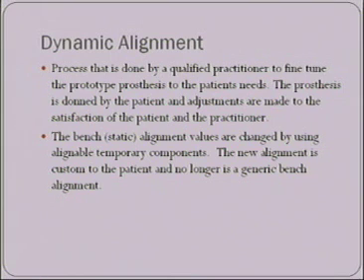But that's okay because the new dynamic alignment is way better than whatever the bench alignment could have been. So we never want to go back to the bench alignment, because after it's been dynamically aligned, that's the new patient's custom alignment for that prosthesis.